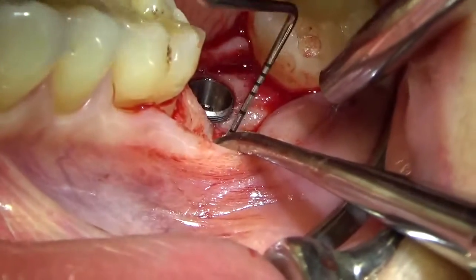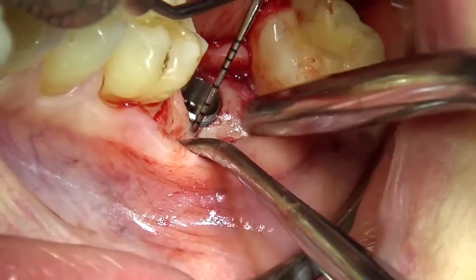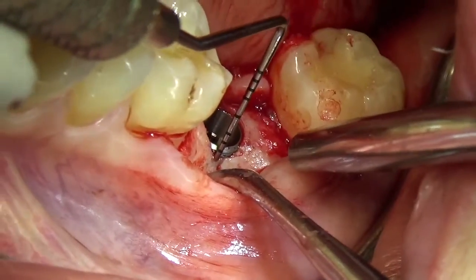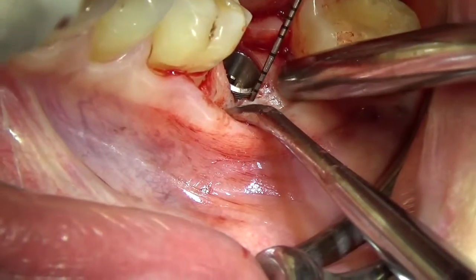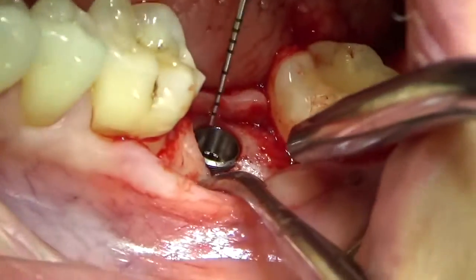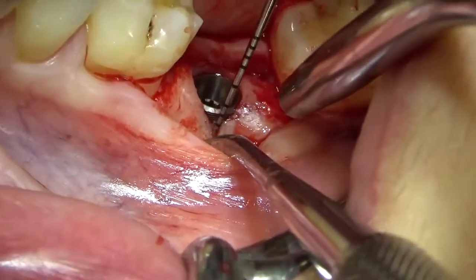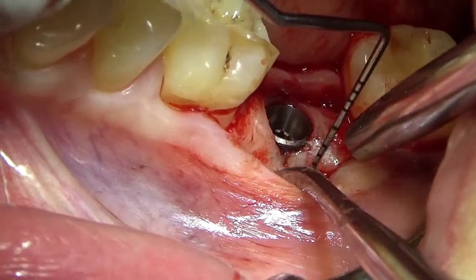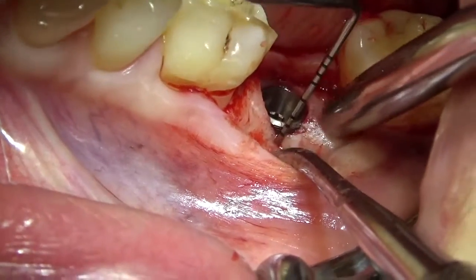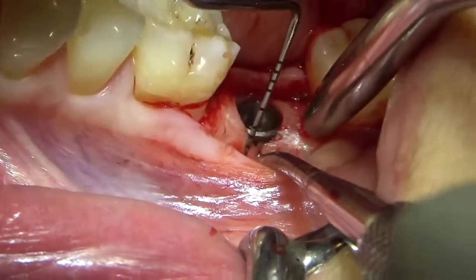Well, I noticed a couple of things. One, yes, we do have a dehiscence. Pretty small, 1 to 2 millimeter dehiscence. If we look, it is countersunk. It is countersunk. And I can tell how thin this bone is as we go a little bit more to the apical. So that's exactly what we're seeing in the CBCT.